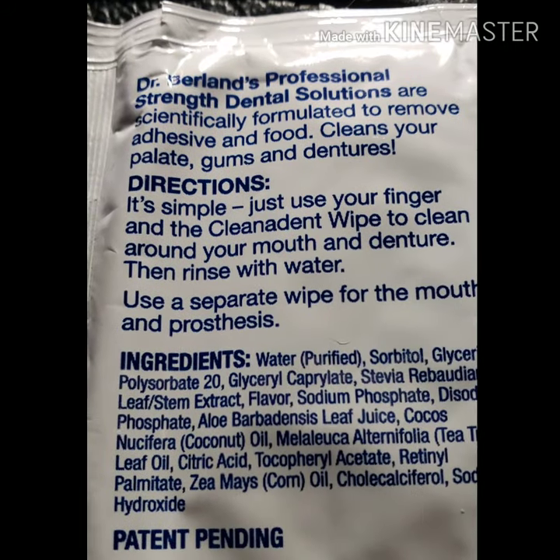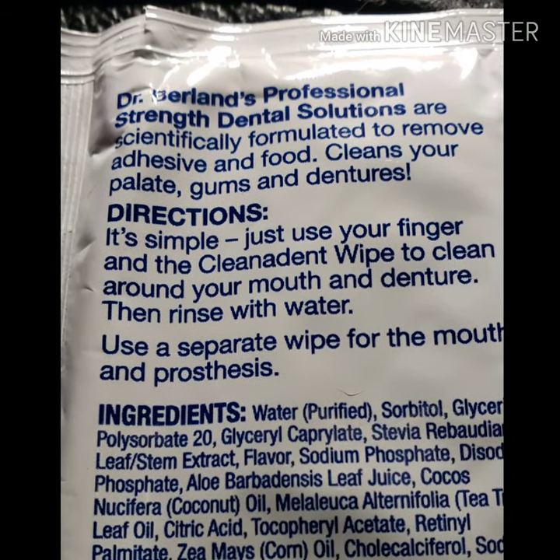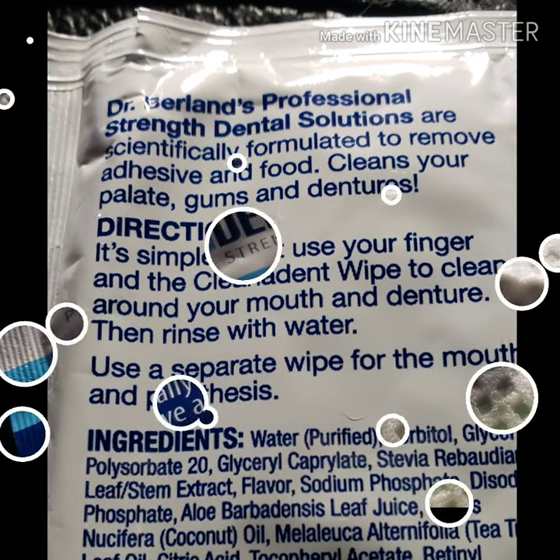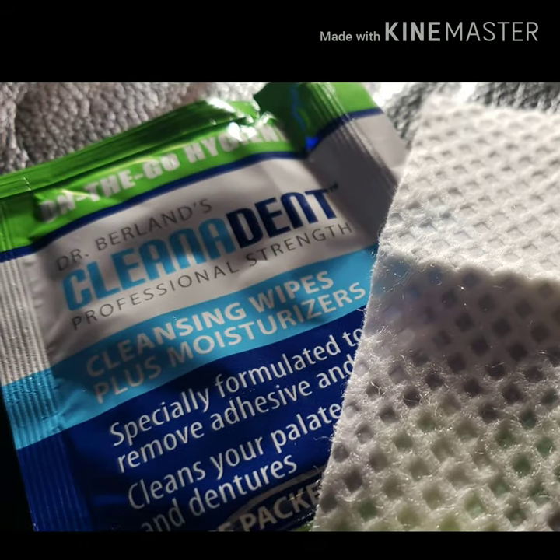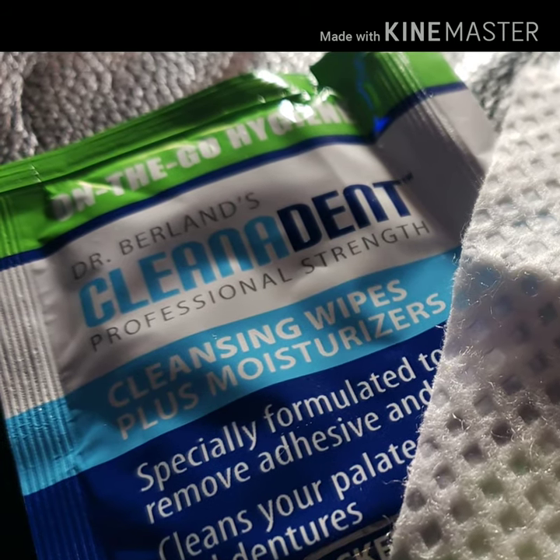This is very easy to use. As it states in the directions, it's simple — yes, it is. Just use your finger and the Cleanadent Wipe to clean around your mouth and the denture, then rinse with water. Use a separate wipe for the mouth and the denture.